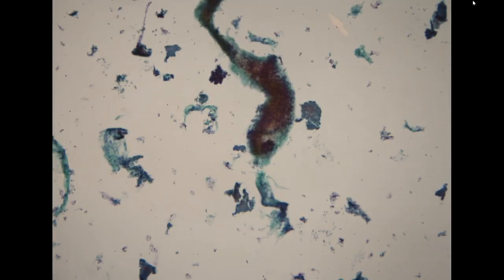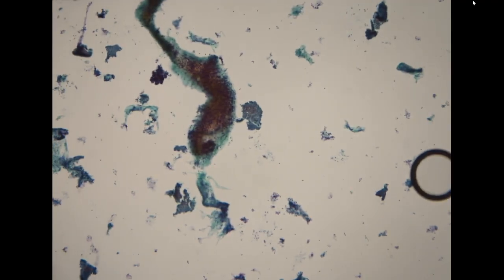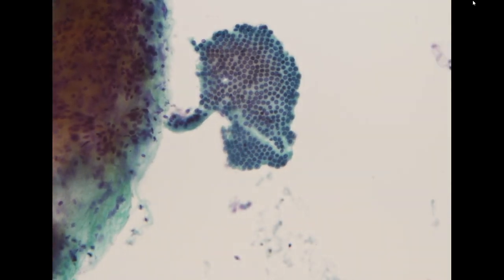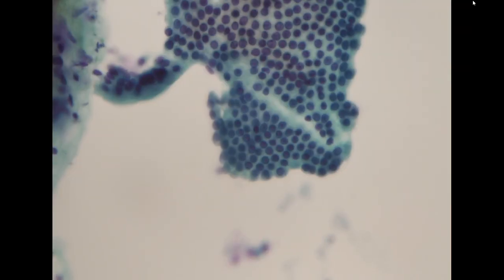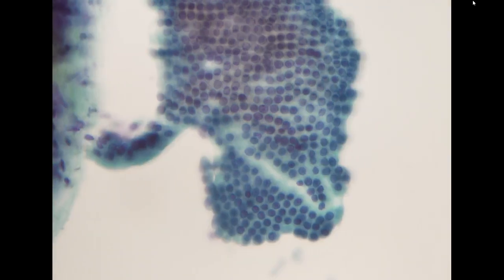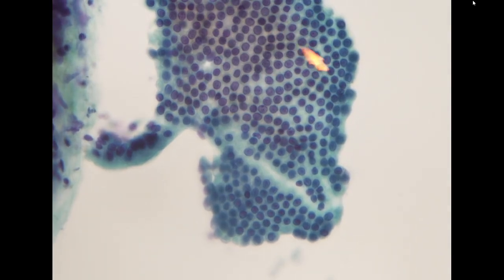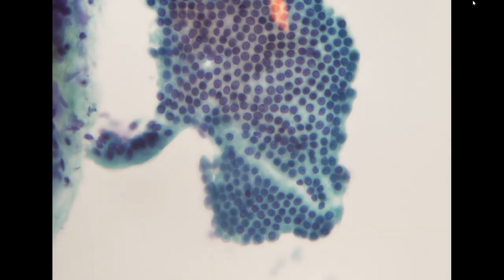So then let's move to some fine needle aspiration. This is again a pancreas specimen. In EUS aspiration, it's very common that we can see intestinal mucosal contamination, which presents as a very uniform honeycombing arrangement, a very flat, large sheet.